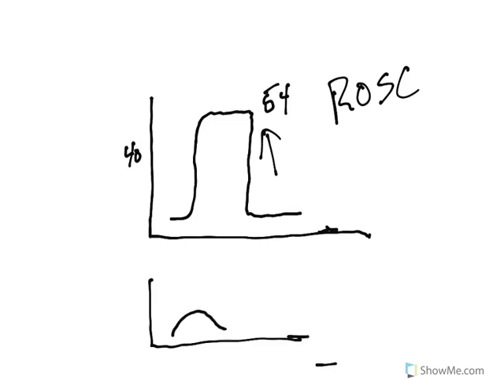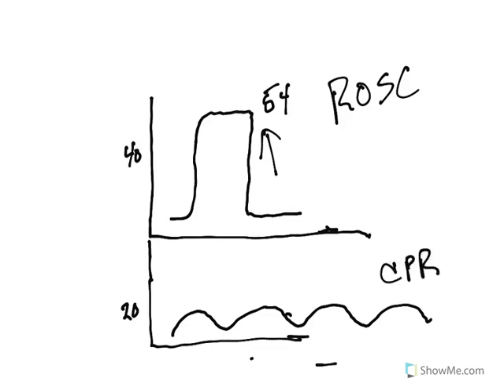We talked about what this is. Generally, this is CPR. This kind of humpy shape actually tells me that I'm doing CPR. Usually the number here is low, so let's say maybe it's 20 here. So that means this extends quite a ways up. But this would tell me that I'm doing CPR. That change in intrathoracic pressure is what's giving me that readout on my end-tidal CO2, and so this is usually indicative of CPR. Okay.